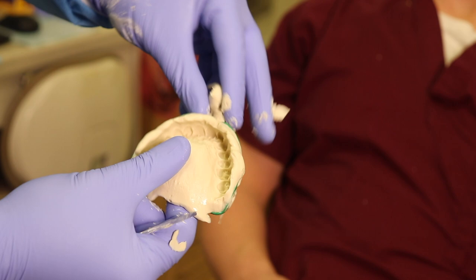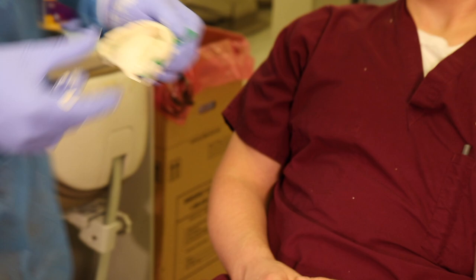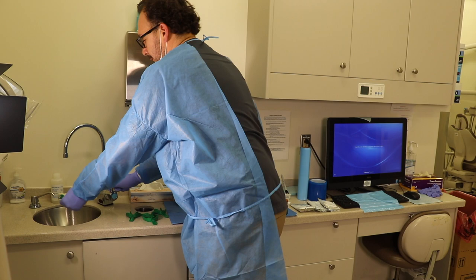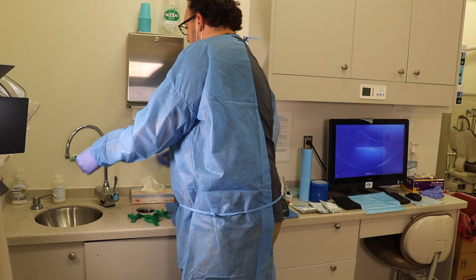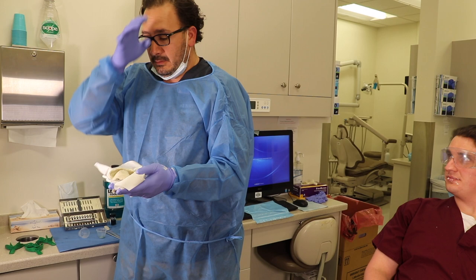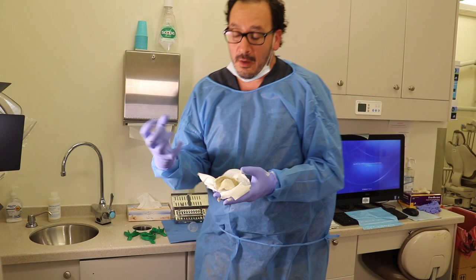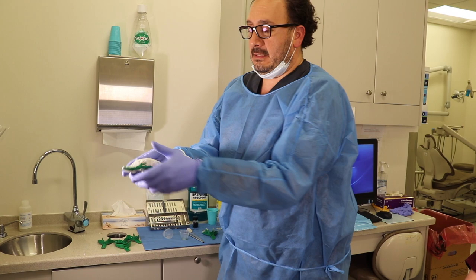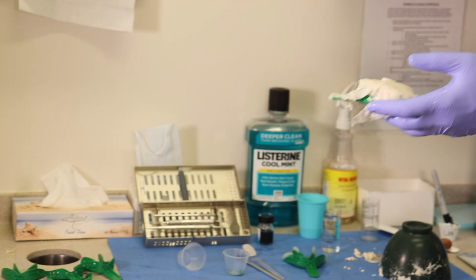So what do I do with the impression after this? Something very important. I need to go ahead and disinfect the impression, rinse it out. And right now, the irreversible hydrocolloid is going to start going through some phases, such as syneresis and imbibition. Okay? That means it'll start absorbing or expelling water. So what I need to do is give a 100% humidity environment for the next half an hour maybe, while that gives me the time to take the second tray, the second impression.